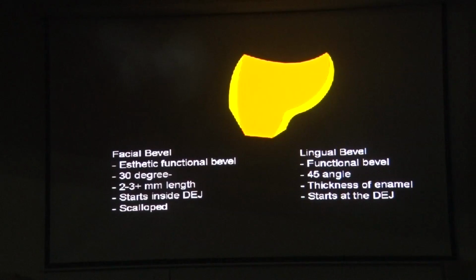Now you know why that line is there? Because you have missed one bevel. It's a simple trick. When you do a class 4 build-up, you give two bevels on the labial, one on the lingual. Now the first bevel is a long bevel. That's a bevel on enamel and dentine which is 2 millimeters wide, but the depth is only 0.5 millimeters. When you give that long bevel, you get a straight line. Am I right? You get an absolutely straight line, and that is what is seen once you finish.